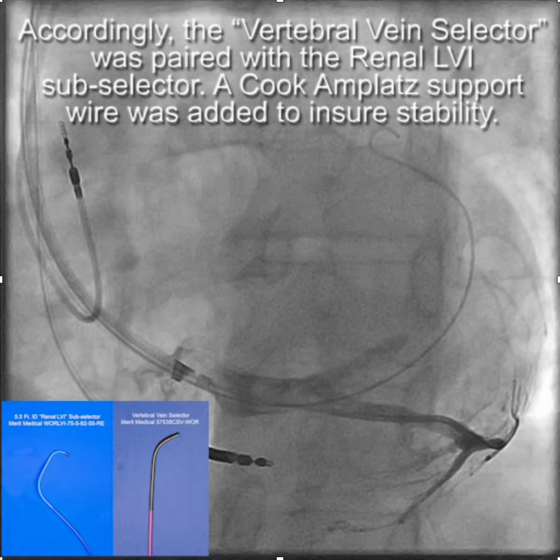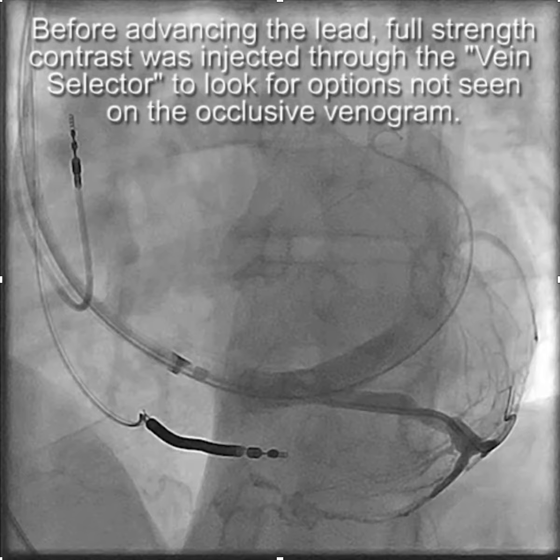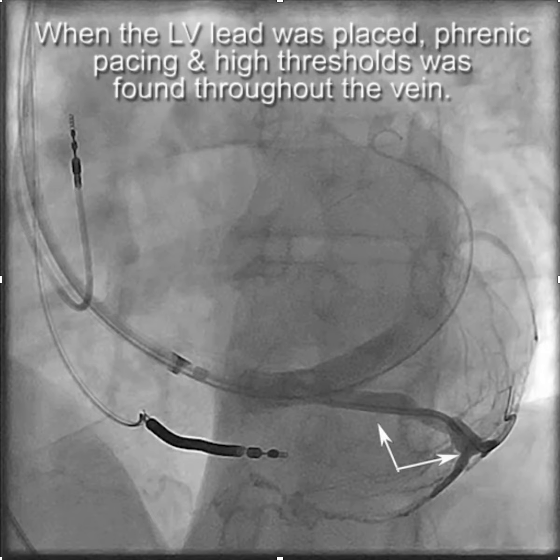Before we put the lead in, we injected full-strength contrast through the vein selector to determine whether there might be other options for LV lead placement, in case the LV lead in this branch didn't give us satisfactory results. When we put the lead in, it turned out there was phrenic pacing.